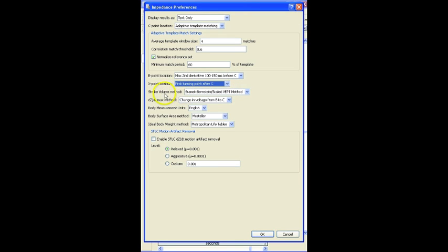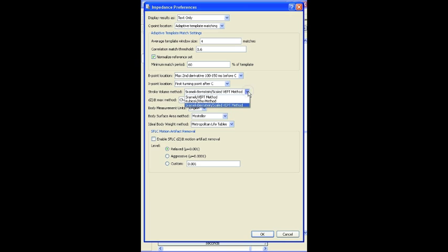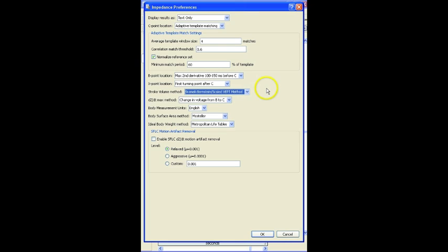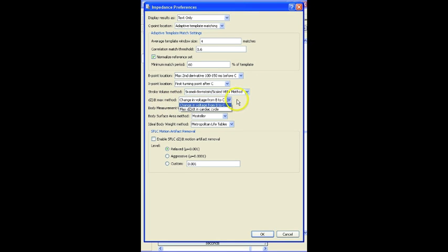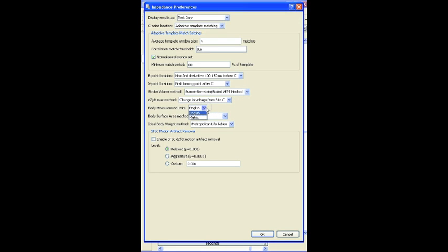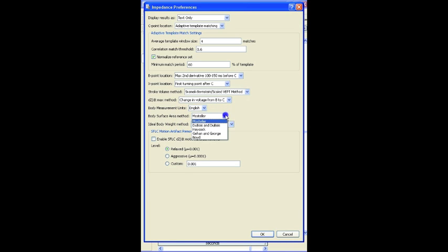Stroke volume method. This comes into play when you're doing the full analysis and we're taking all the measurements. There are a number of methods that are used for that. SRAMIC, KubeCheck, and then SRAMIC-Bernstein. Default one is this SRAMIC-Bernstein. DZDT method, a couple of options there. And then the units that are being used, either English or metric. Surface area method, if you're doing the surface area analysis, options for that. And then the ideal body weight method that's being used, again, default being the metropolitan life tables.